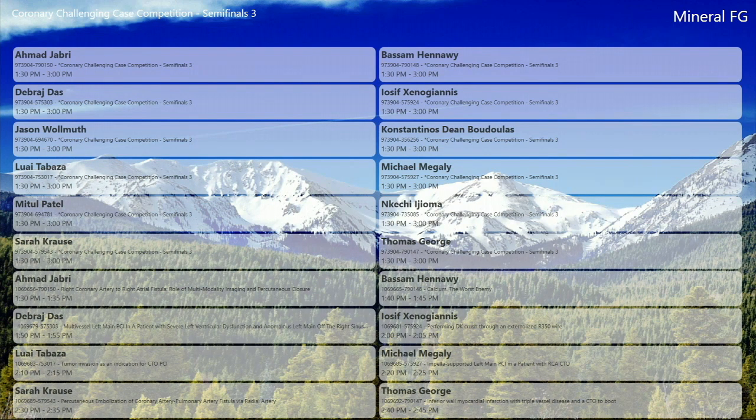Yeah, I totally agree with that. I think the other option is if you could lay out a view where this looked like it came off of the cusp. Is that correct? Not the right coronary itself? Yeah. If it had come off the coronary, you have the option of putting a covered stent in the coronary, which is a lot easier to do and will get you a much better seal. Sometimes, as Jason's saying, you need so many coils that you end up compressing the right atrium with just the coil burden. So it's nice to just seal off the neck of it if you can, but it doesn't seem like that was an option in this case.